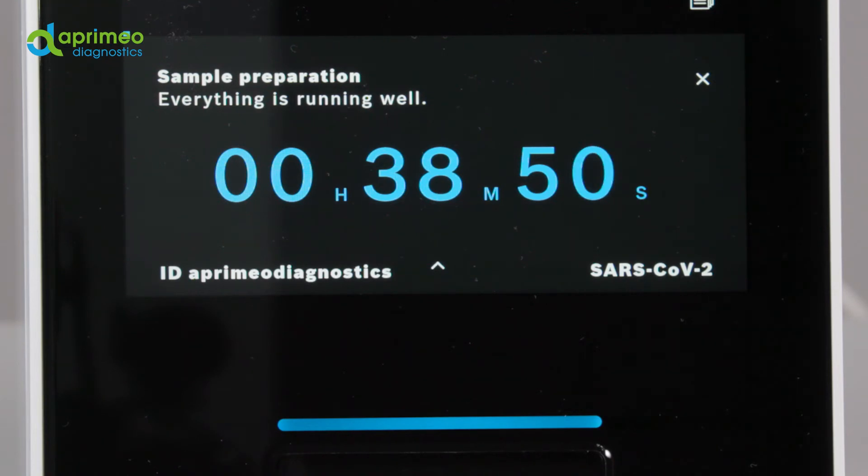During a test, you can see on the display the current test status and the remaining test duration. In addition, you can have the sample and test information displayed by pressing the arrow up icon. Pressing X in the upper right-hand corner will abort the test.